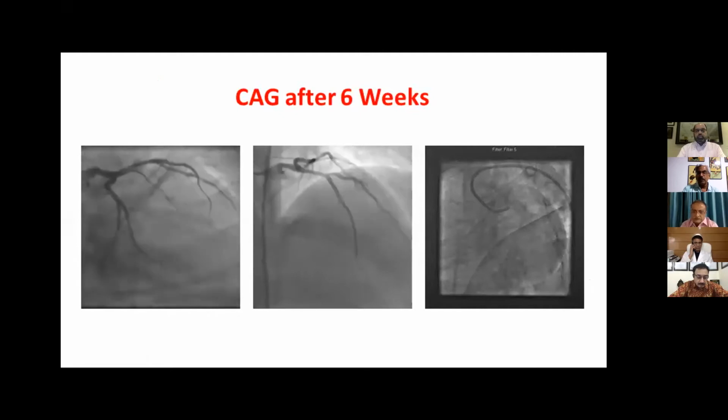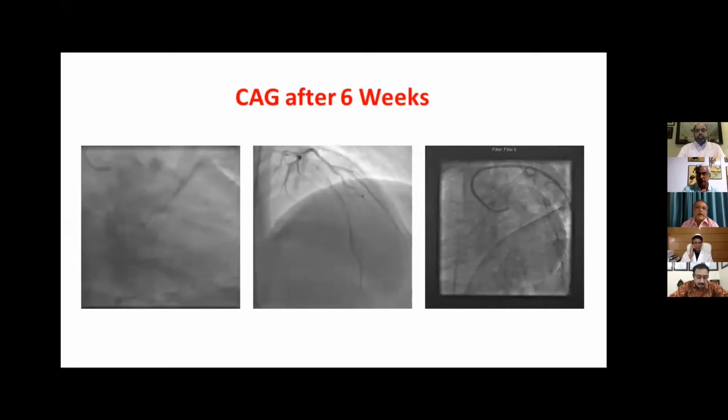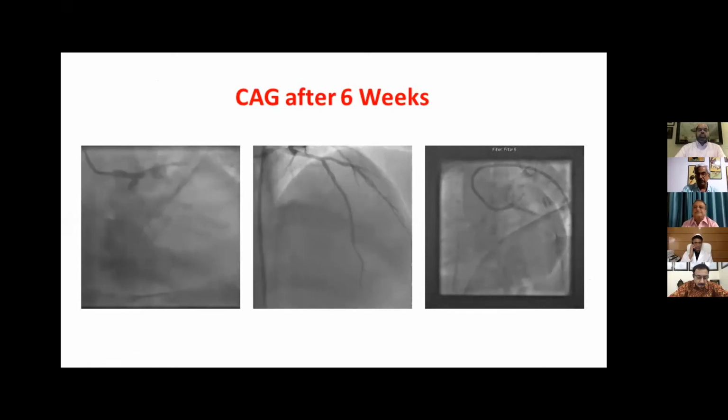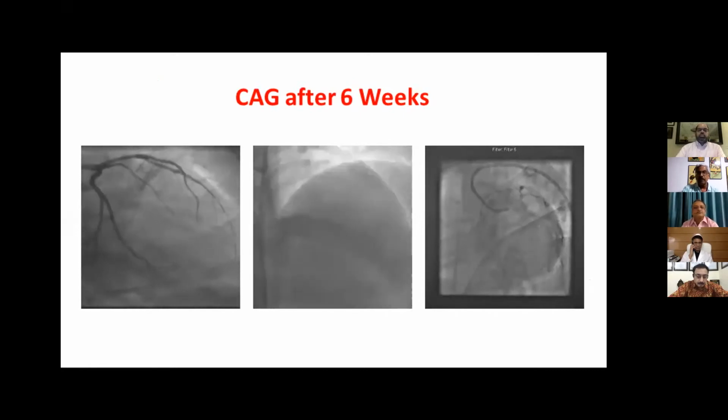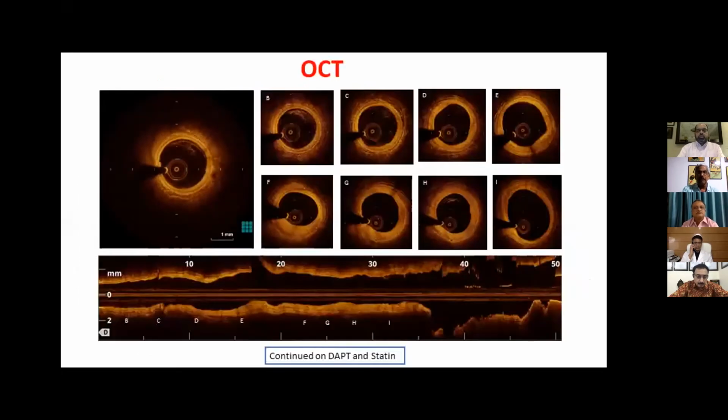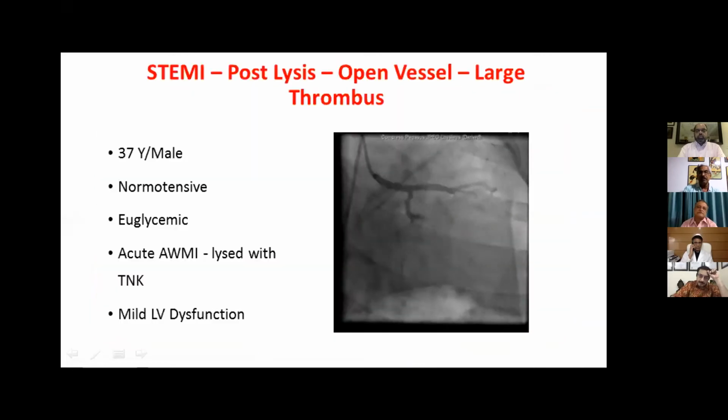And this is a typical thing which has never been reported. We have all this data now submitted to JACC for presentation on young MI, with two-center data on 72 patients. And you can see we have avoided stents in most of these patients and cleared them up with anticoagulation and antiplatelet therapy. So I'm going to go very quickly now.